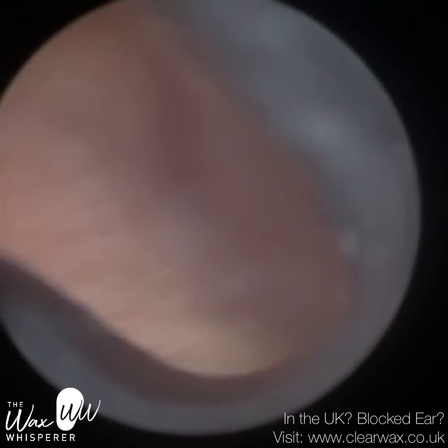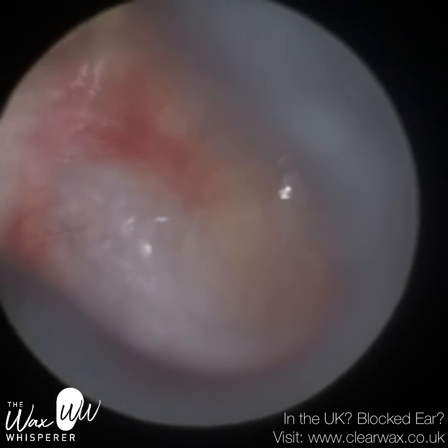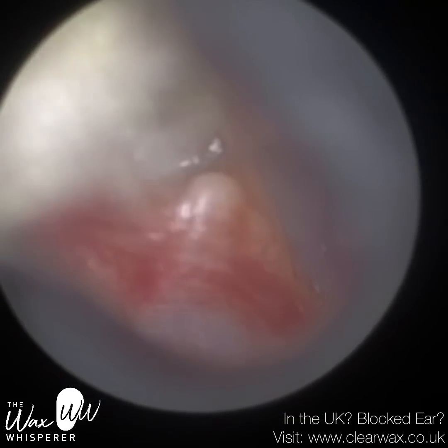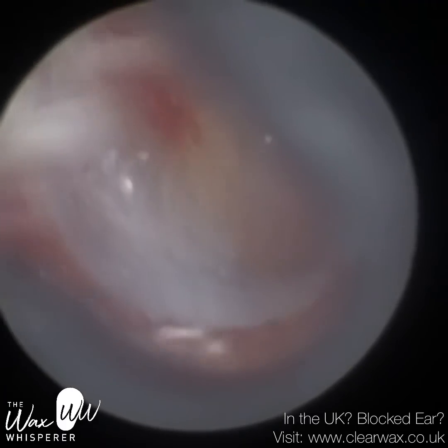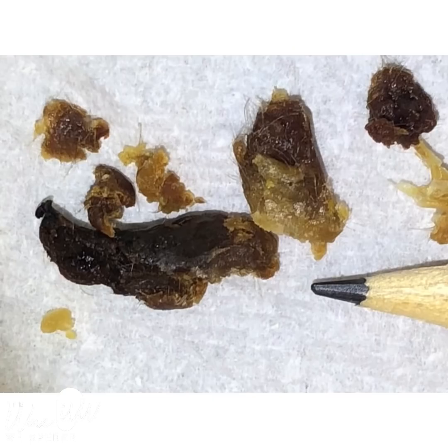I'm going to put the speculum in. You can see how narrow the ear was and how bendy it was. So I'm going to stretch it open, go in with the speculum, and straighten up the ear canal. And then we're just moving it to the top. The patient's also got an attic retraction there. Good view of the eardrum — that view is so good compared to what else is available other than an endoscope.